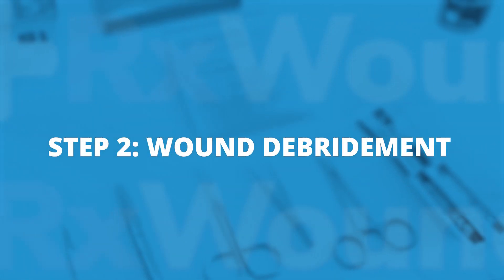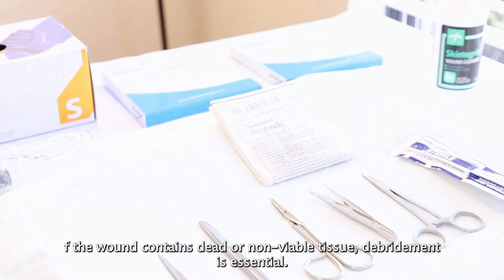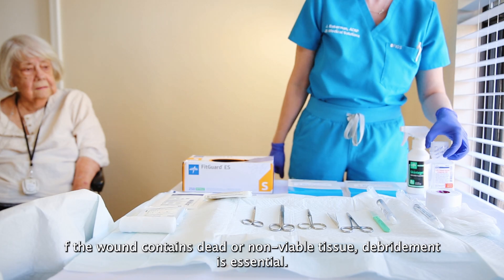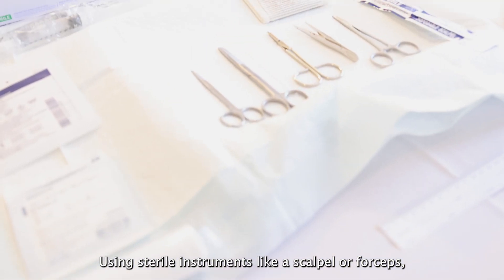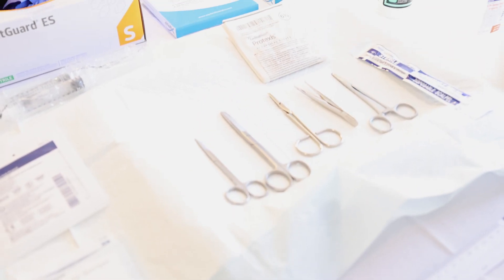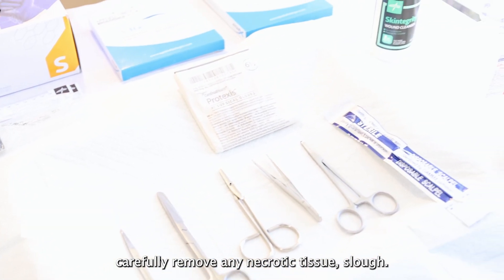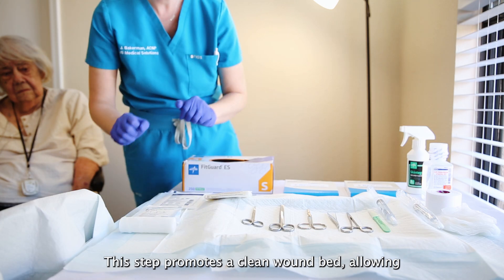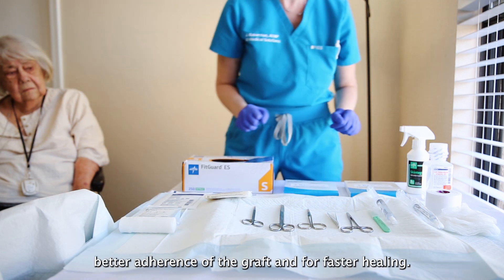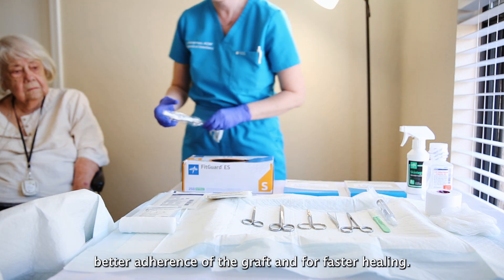Step 2: Wound Debridement. If the wound contains dead or non-viable tissue, debridement is essential. Using sterile instruments like a scalpel or forceps, carefully remove any necrotic tissue or slough. This step promotes a clean wound bed, allowing better adherence for the graft and faster healing.